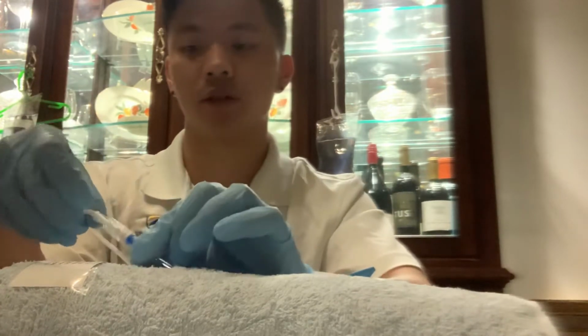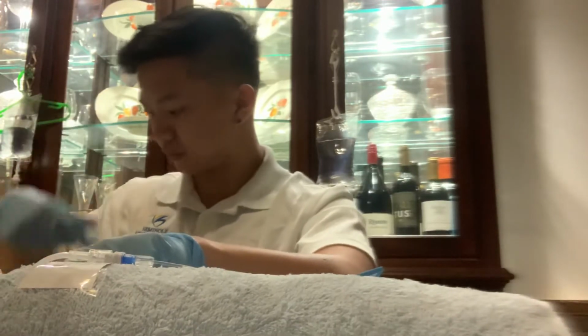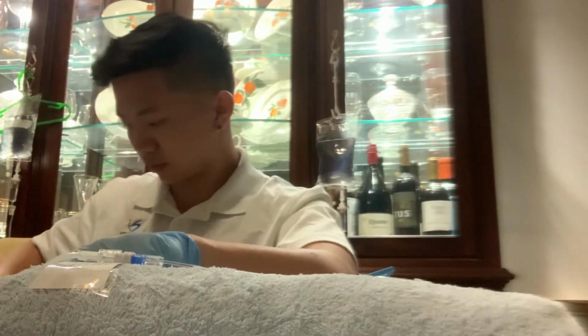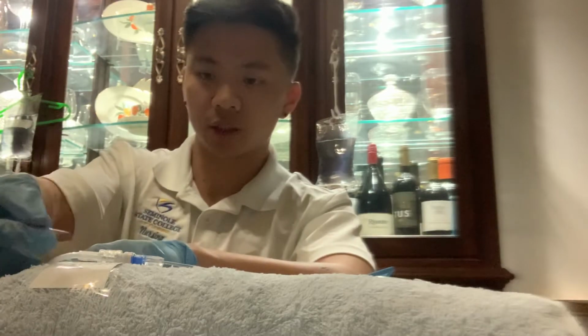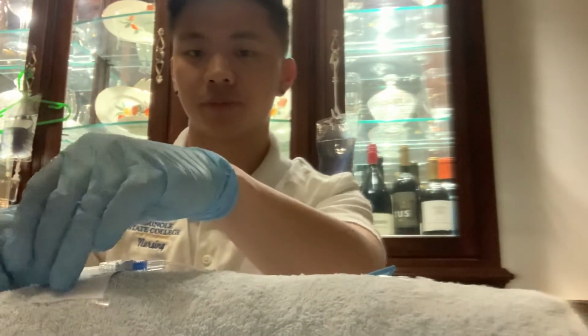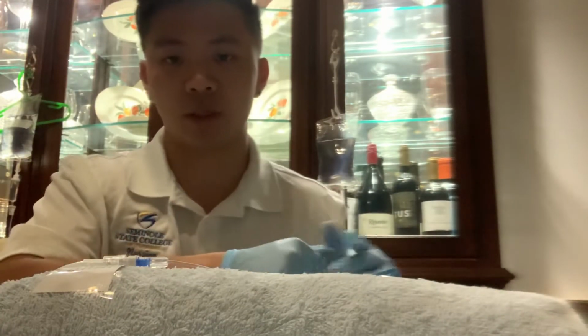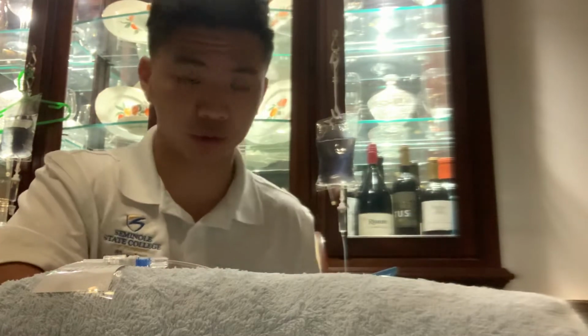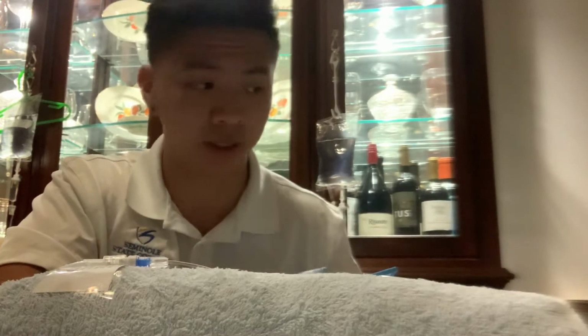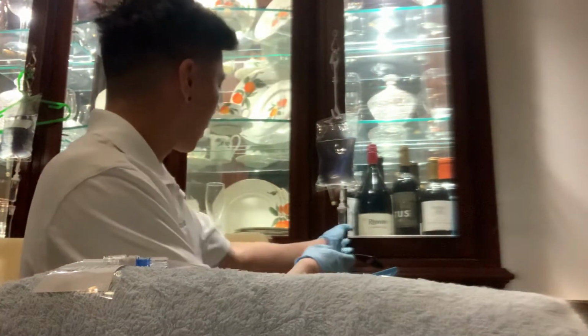Alright, once it's secured, I'm gonna go ahead and tape it down, secured to the wrist of the patient. Now, after securing it, I'm gonna go ahead and adjust the roller clamp to 21 drips per minute. I'm gonna go ahead, have my watch.